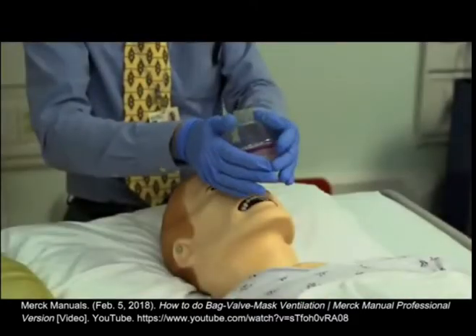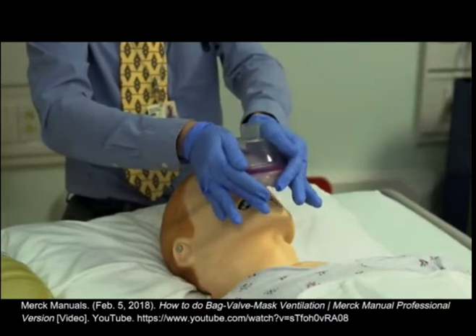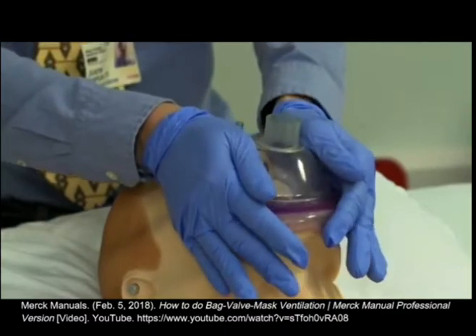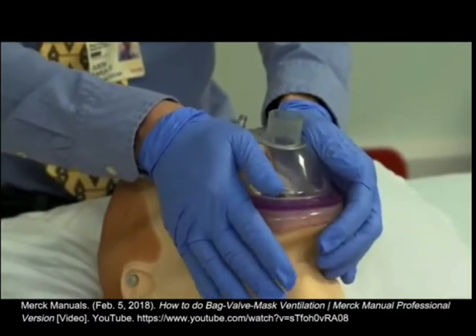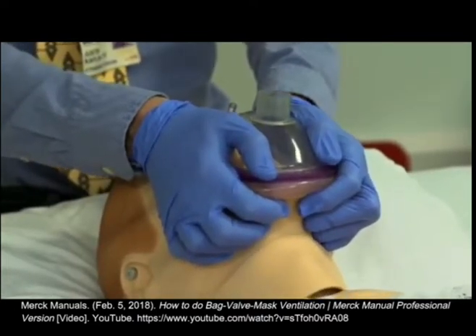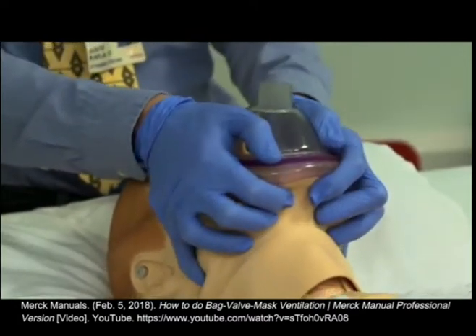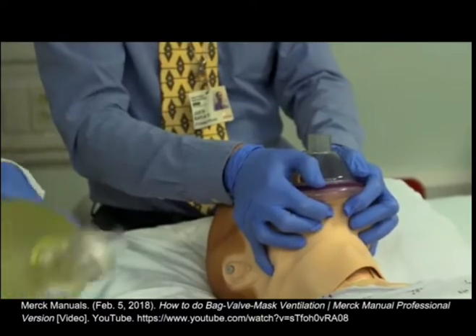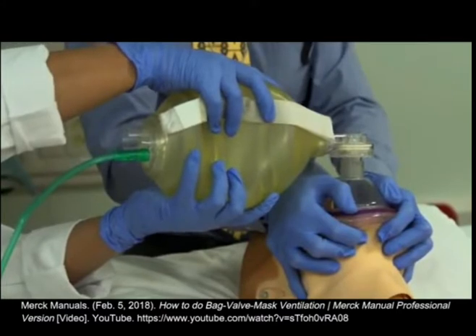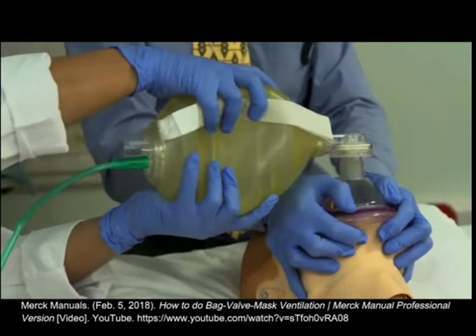An alternative method can be used in which the stronger thenar eminences hold the mask to the face. The first clinician puts the base of his thumbs parallel to each other along the lateral edges of the mask. The mask is then lowered onto the face, and the fingers are placed under the mandible. The mask is pressed to the face with the thenar eminences while the fingers pull the mandible upwards. Chin lift and jaw thrust may be applied concurrently. This technique is easier to perform, allows the use of stronger hand muscles to maintain a proper seal, which minimizes fatigue, and enables 4 fingers rather than 3 to do the chin lift and jaw thrust.